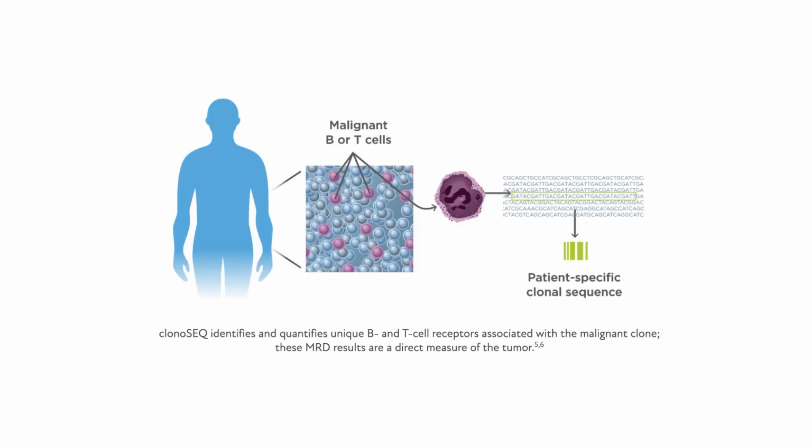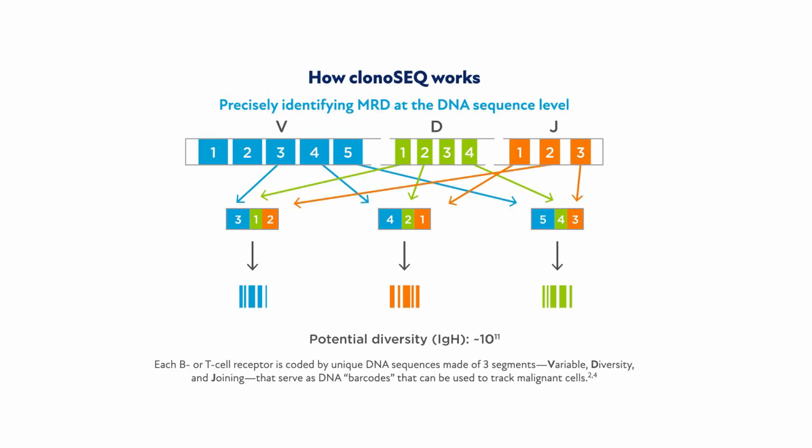One of the companies is called Adaptive Biosciences, I think, and they have this test, FDA approved, where at the initial time of diagnosis, we sequence and detect a very specific DNA segment, and we use it to monitor the patient's progress. What they are using is the immunoglobulin VDJ regions. The number of combinations in any given patient is 10 to the power of 11.